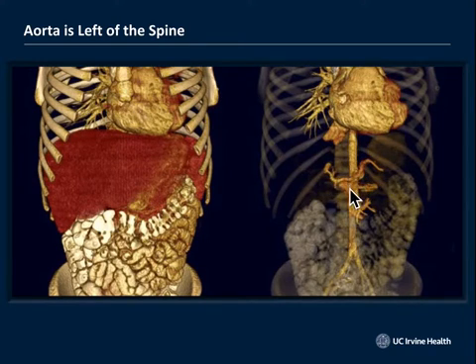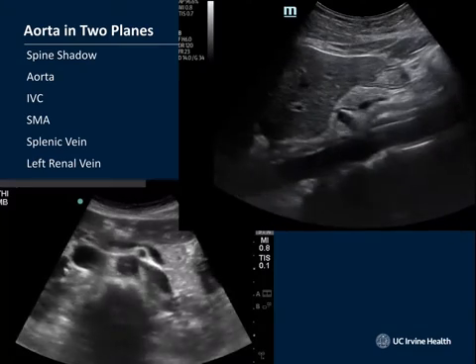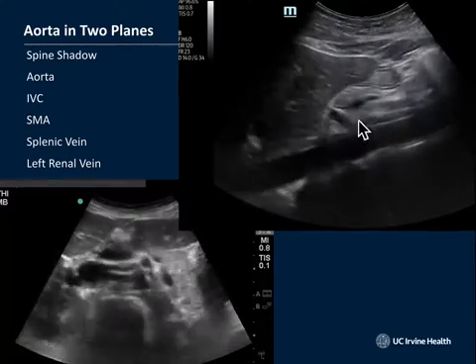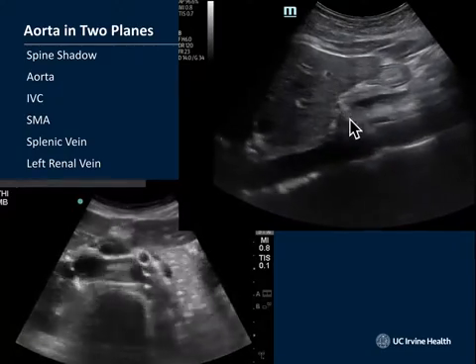And then distal to that, you'll see the superior mesenteric artery branch off as the second largest branch off the abdominal aorta in the upper abdomen, bringing blood to the intestinal structure. So we can see that here. Here's the sagittal view here of the aorta. We see both the celiac and the SMA coming off in that sagittal view.